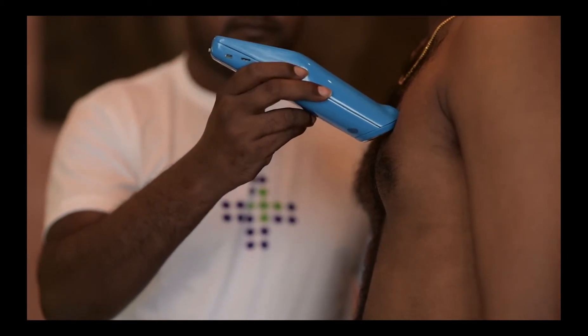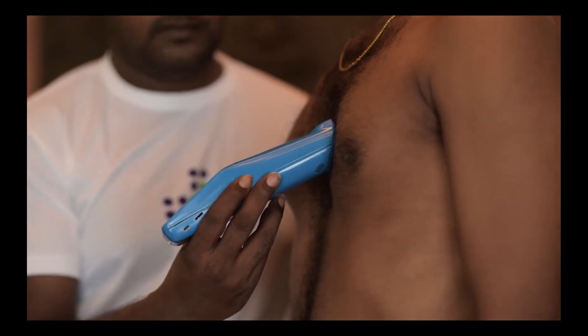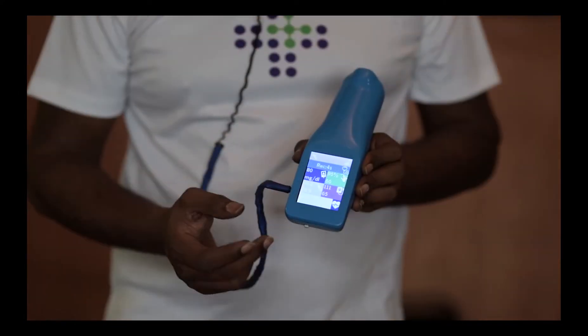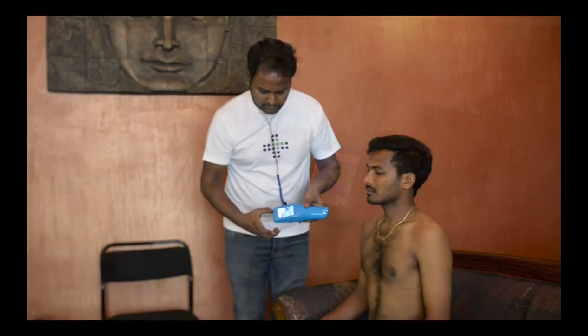This is the wrong way to measure auscultation. Now the diaphragm is placed correctly to measure the heart and lung sounds. We shall now see how this operation is kick-started. We press the icon for auscultation. The mic gets highlighted.